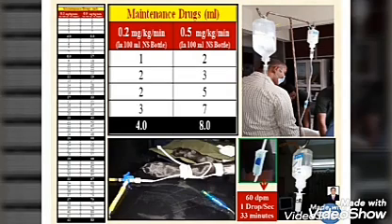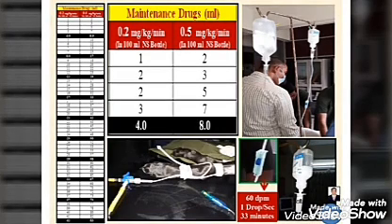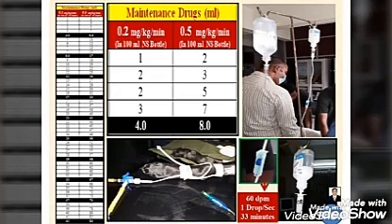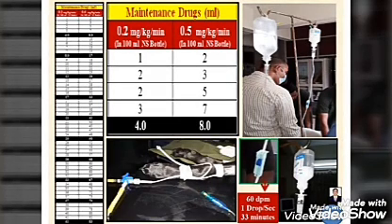So it sets the 0.5 milligram per kg per minute rate of infusion of the propofol, and it's connected with the 3-way connector, and one more 500 ml normal saline bottle can be fixed on the IV stand for intravenous patency. So a 100 ml bottle is sufficient for up to 33 minutes at 60 dpm, and after that period replace it with a new bottle at the same rate.